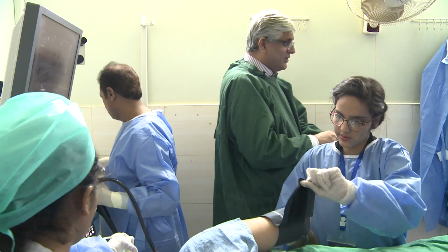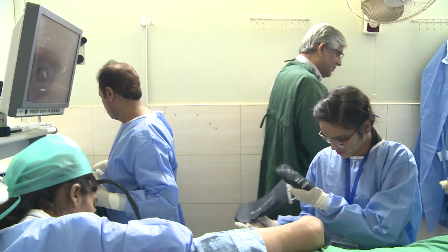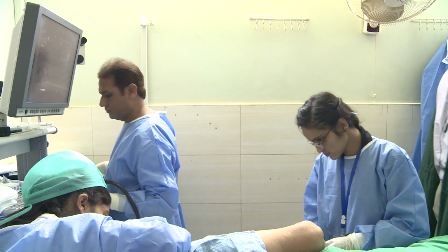My level of EUS you can reach very quickly. Beyond that, you have to work very hard.